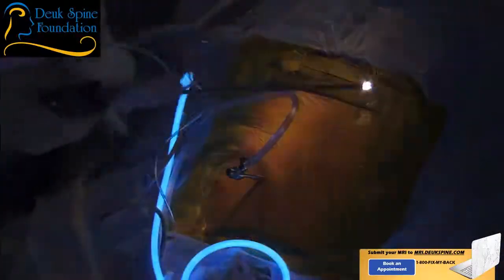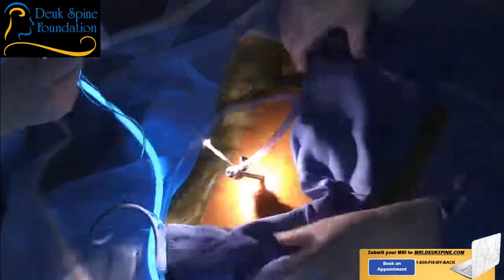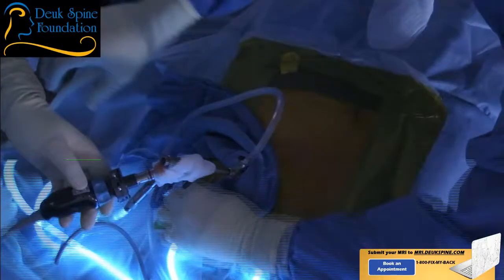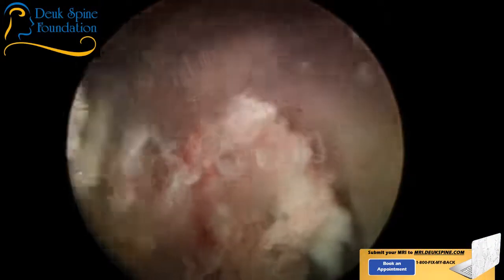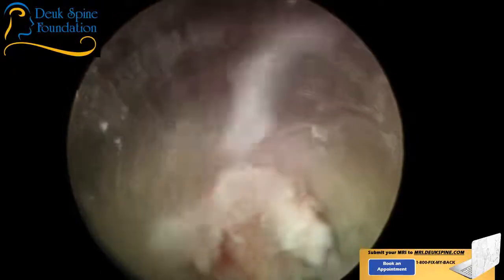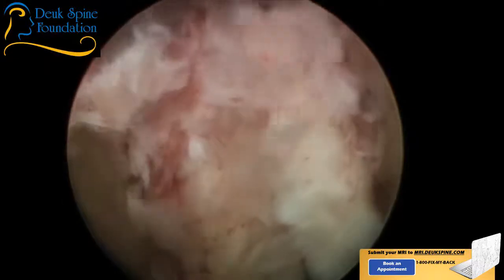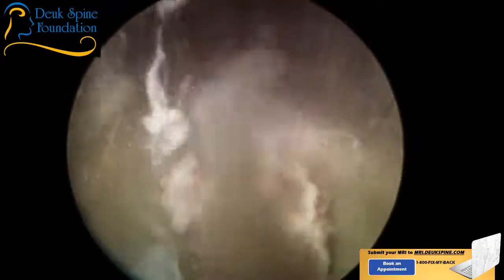All right. This part won't be as painful for him right now, but once I get closer to the outer annulus, it will get more painful. Okay, scope is on. We are inside the disc. Let's get the laser going. No, it's this hand. Okay. That's the disc right there. Let's have the grabber and the laser. Grabber first, then the laser.